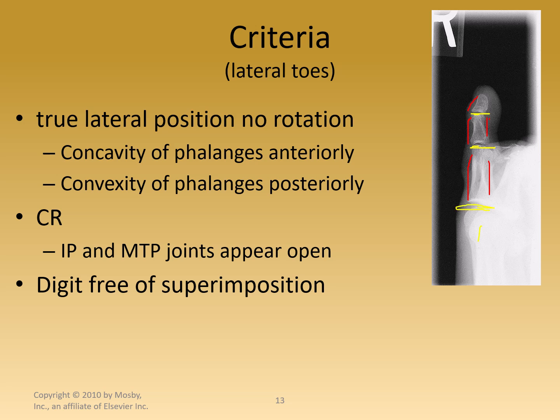And then remember, we still have to see half of that metatarsal there, all right? So we have distal phalanx, middle phalanx, proximal phalanx, and then the metatarsal there. All right, and then we'll look to make sure that we have more soft tissue margin on the plantar surface, right? We'll see more soft tissue on the plantar surface.